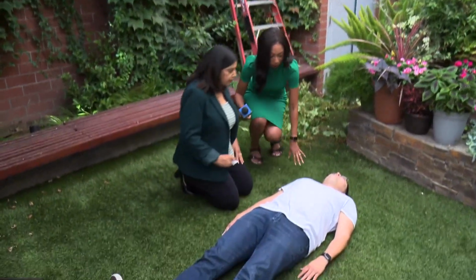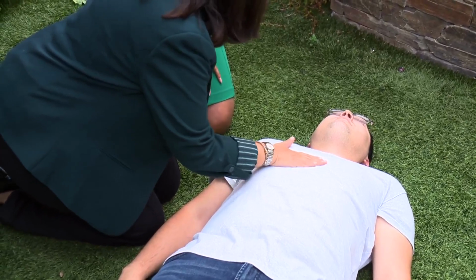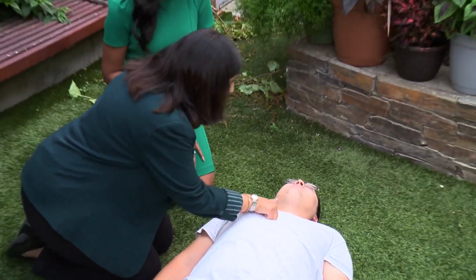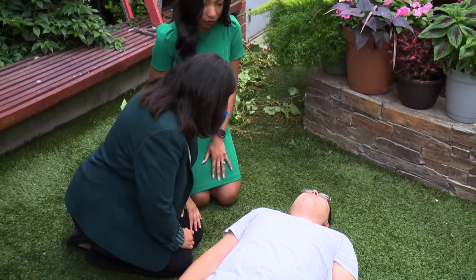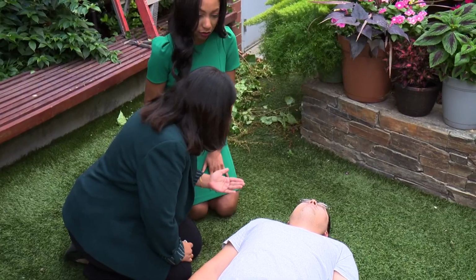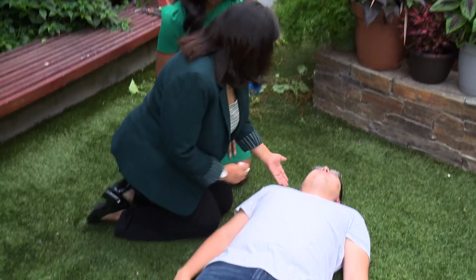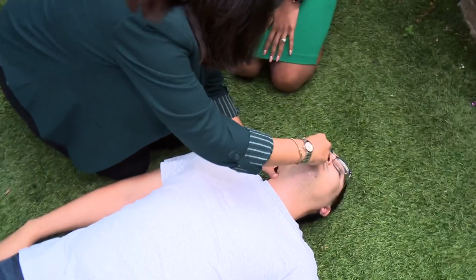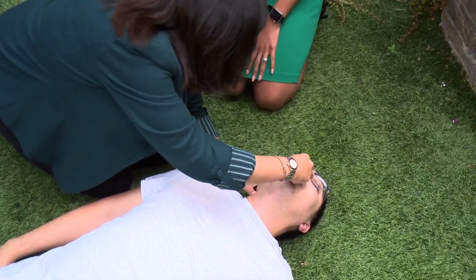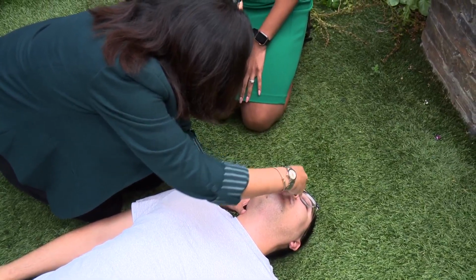So get on the ground at the chest level, try to wake them up. Okay, Brandon, can you hear me? All right, you do something called a sternal rub, which kind of wakes up a person if they are not ODing on opioids. Once you know that they are not responsive, all you do is you tilt their head a little bit, take the Narcan, push it up their nostrils until your finger hits the nostrils, and then just spray.